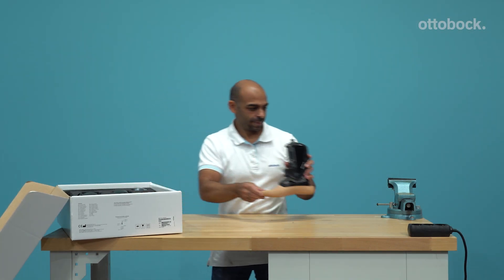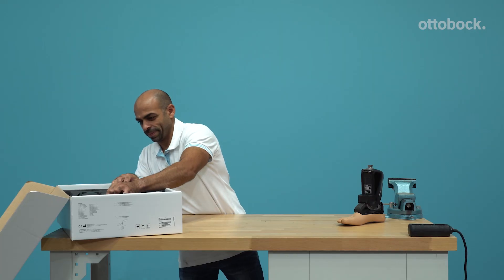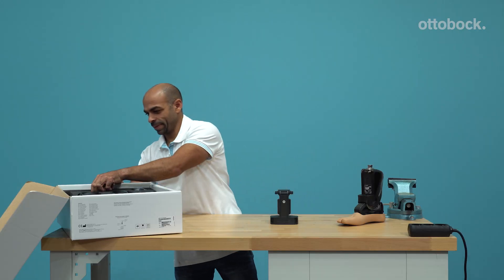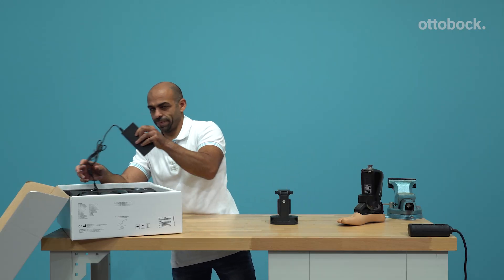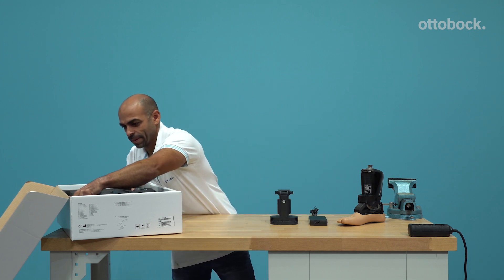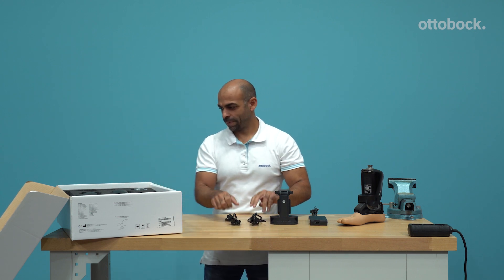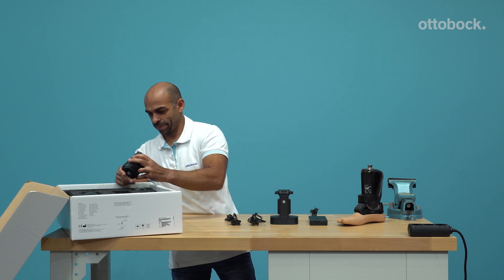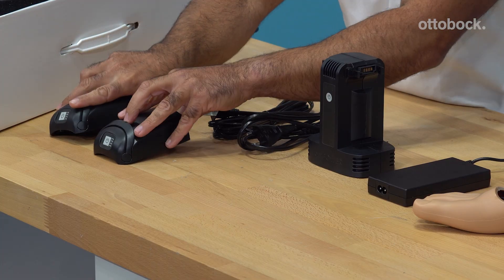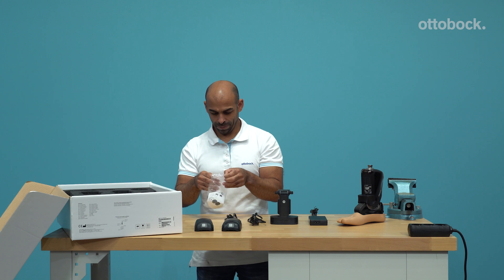Empower's scope of delivery includes the foot module, including the foot shell and spectra sock, a charger, a power supply, power cords for different countries, and two batteries, and a set of heel wedges to adjust the heel stiffness.